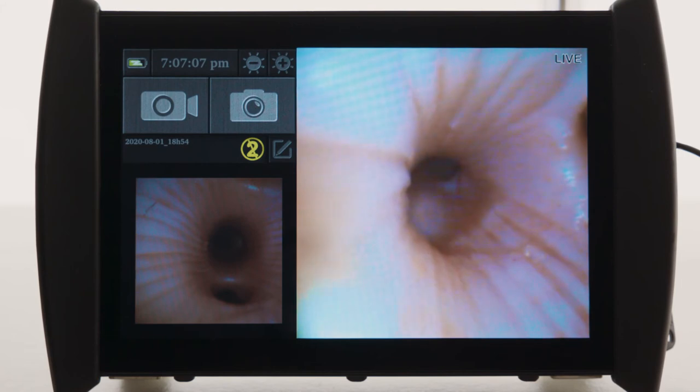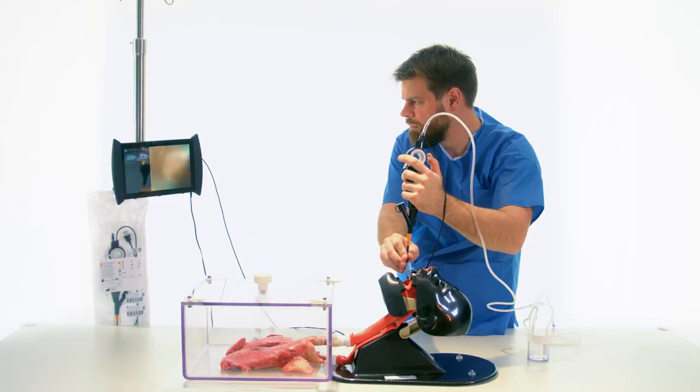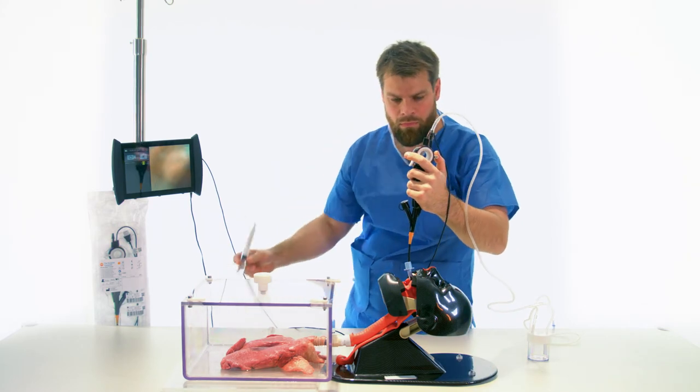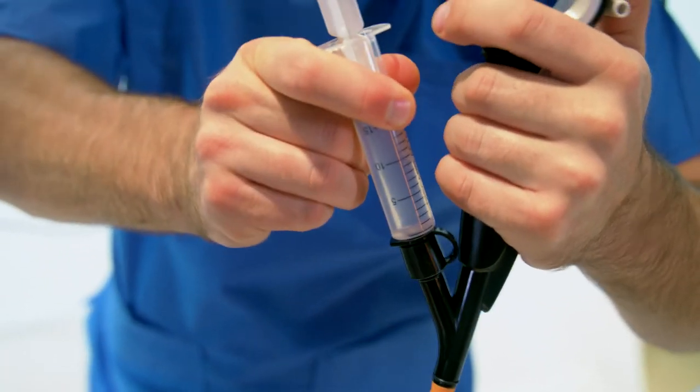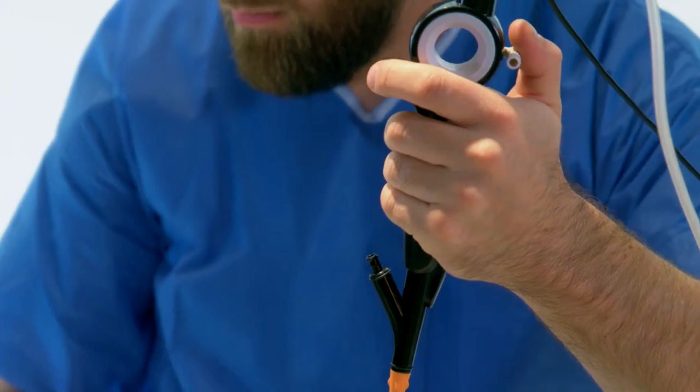The bronchoscope is introduced and maneuvered as close as possible to the zone of interest, where an infection is suspected, for example. Saline solution is instilled with a slip tip or luer lock syringe.